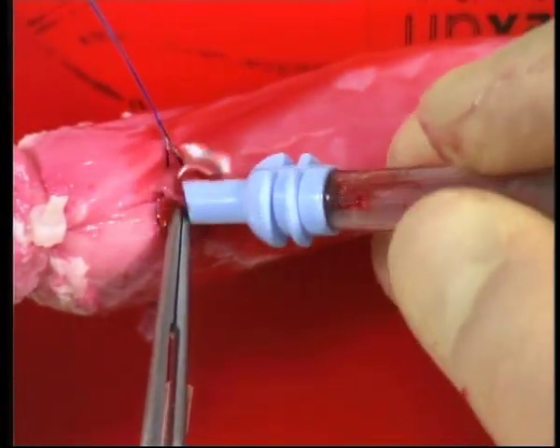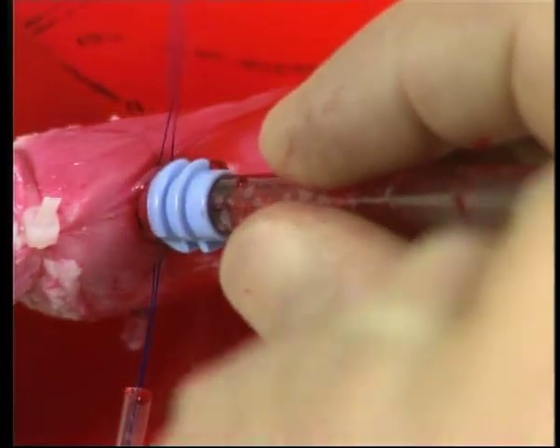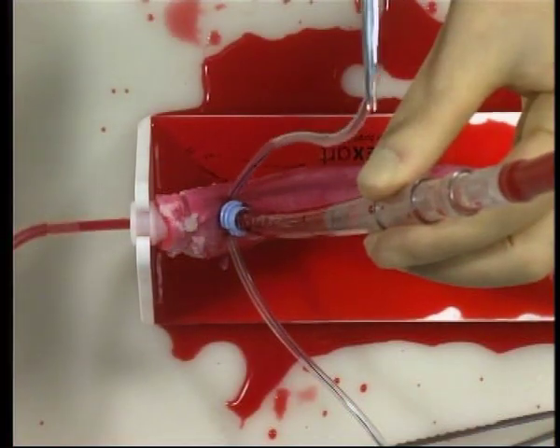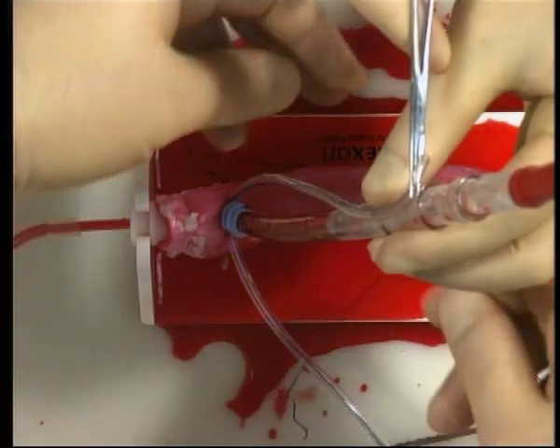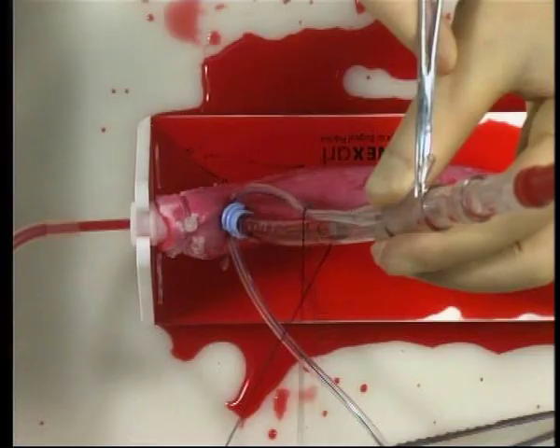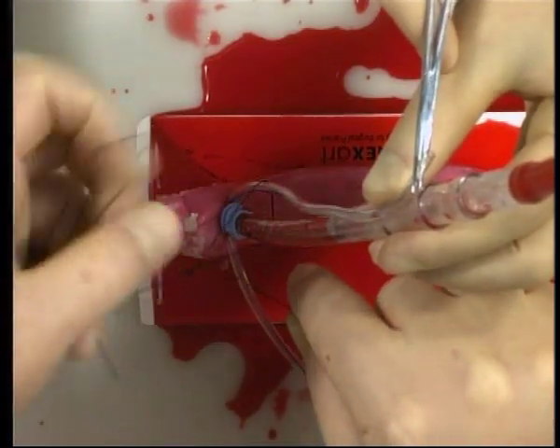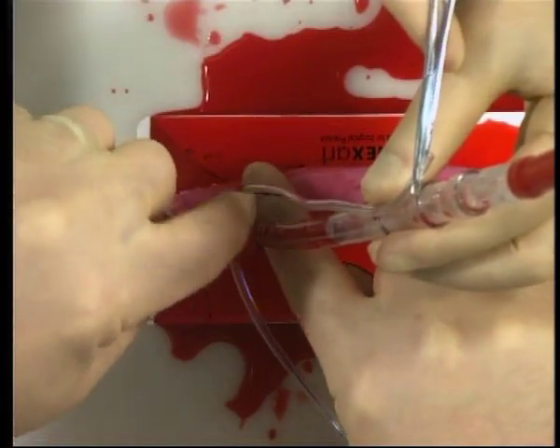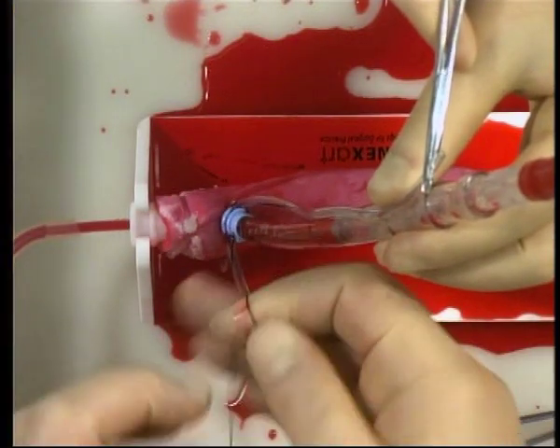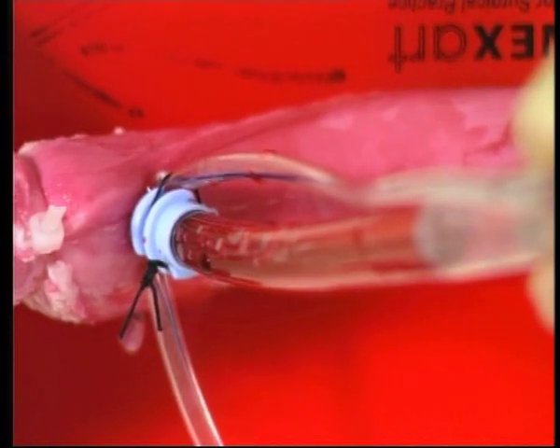The aortic cannula is then simply introduced underneath the flap. The snugger on the assistant's side is tightened and held against the aortic cannula. The two are tied together with a heavy silk suture using the locating grooves at the base of the aortic cannula. The aortic cannula is now secure.